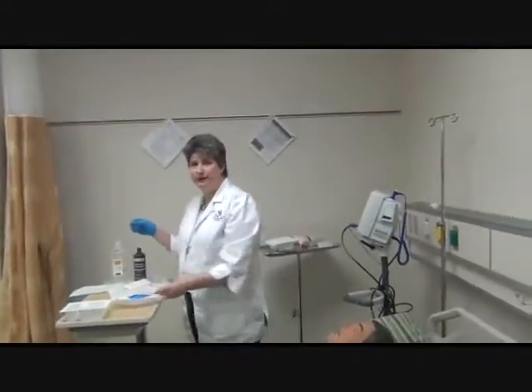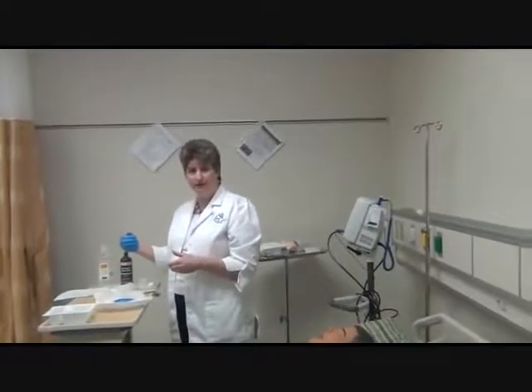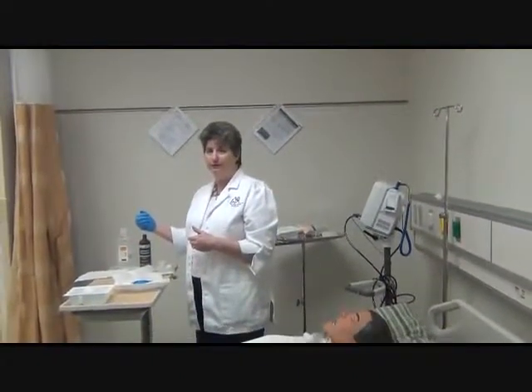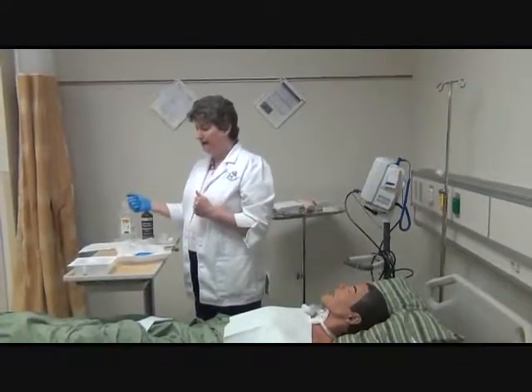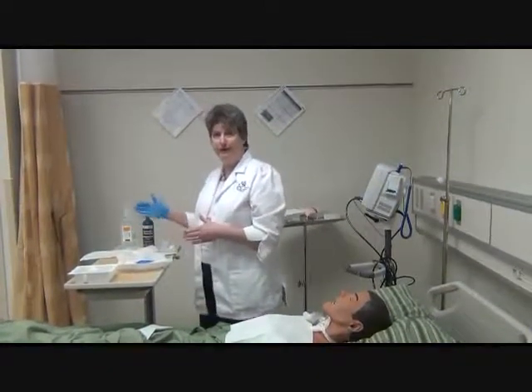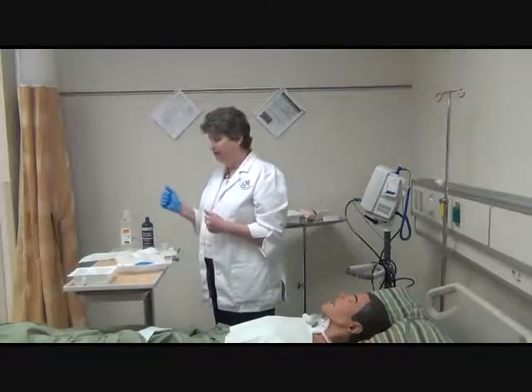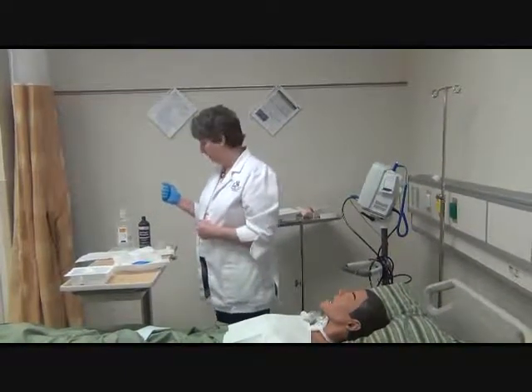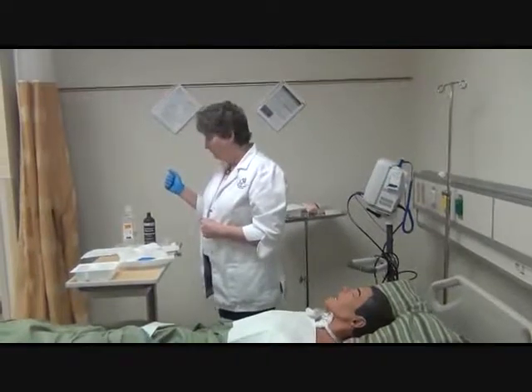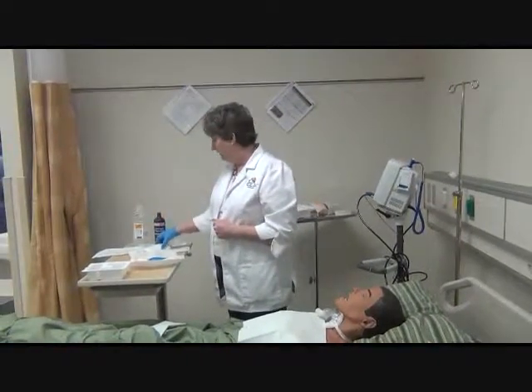Now there's two ways we can do this. We can do the suction catheter procedure, which I think is how I'll demonstrate this, or I can set up both fields and then go from one to the other, but I'll do separate because as students that's usually the easier way for you to learn.